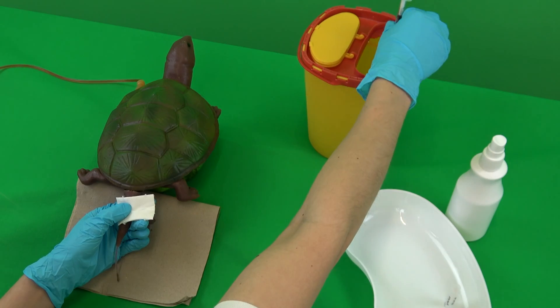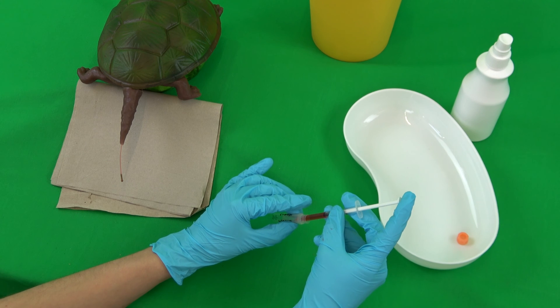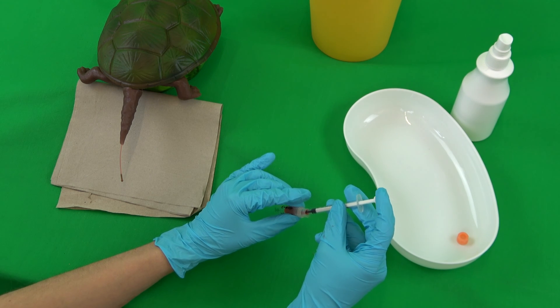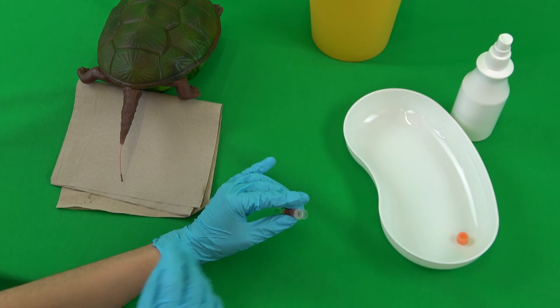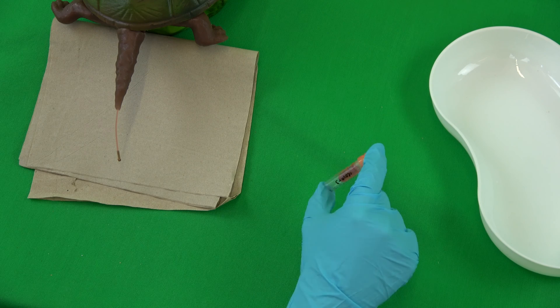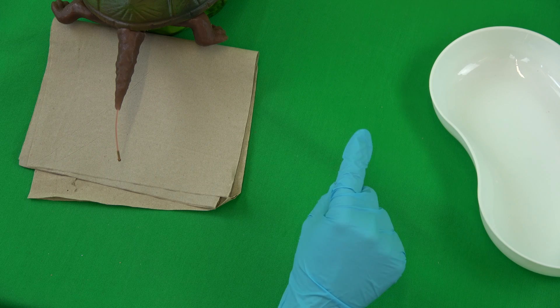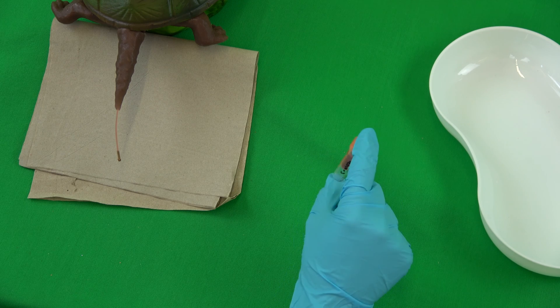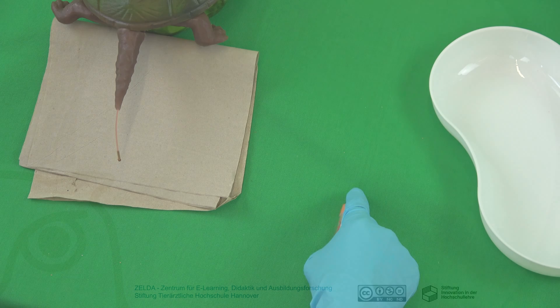The cannula is disposed of in the collection container. In order to avoid clotting of the blood as much as possible, the blood must be transferred to the lithium heparin tube as quickly as possible. The blood is filled in with contact to the wall of the tube, the lid is closed, and the tube is carefully swirled about 10 times. The syringe is thrown away in the waste container.